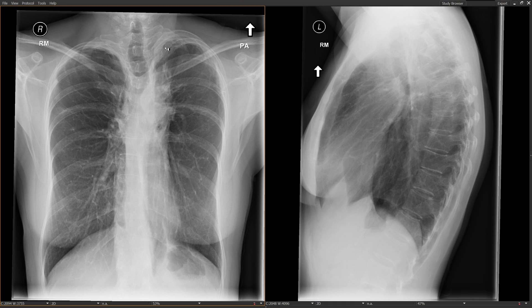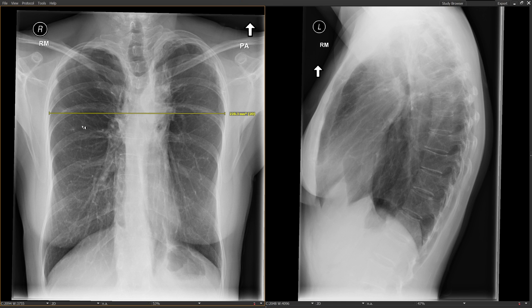Following that up, you can see that reticulation extends to the apices and along the lateral border of the upper lung — so all of this area is radiation fibrosis. In a normal patient, a line bisecting the hila should have an equal amount of space above and below. But in this patient, you can clearly see there's a lot less lung above that line compared to below, giving us upper lung predominant fibrosis — in this case due to radiation.